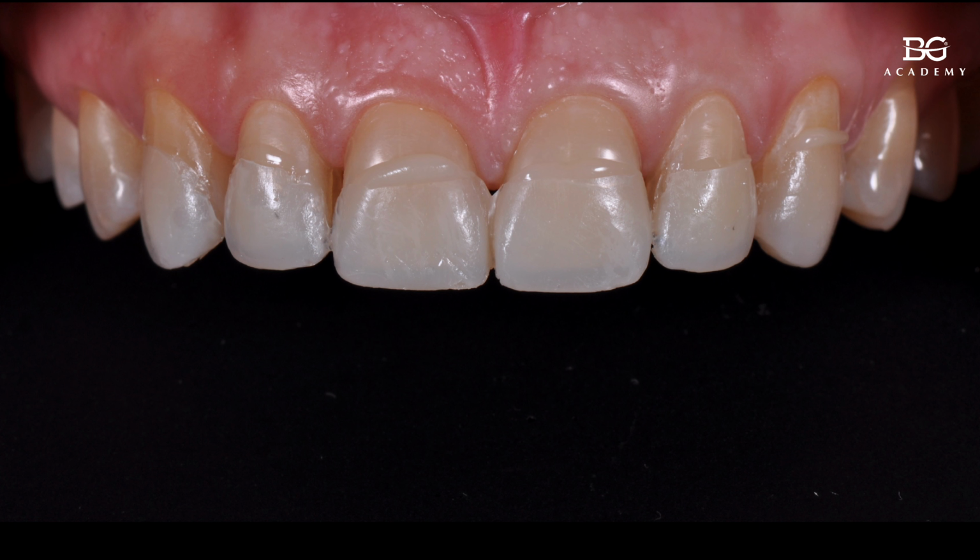And then you take your packable composite, you take your favorite composite instrument, any flat plastic instrument or brush, whatever, and you just add the missing part of the restoration in the cervical area. And in this case, you can make a more or less precise transfer and transition from the tooth to the interproximal areas, including the interdental papilla. So this kind of restoration will be more hygienic compared with the classic approach.